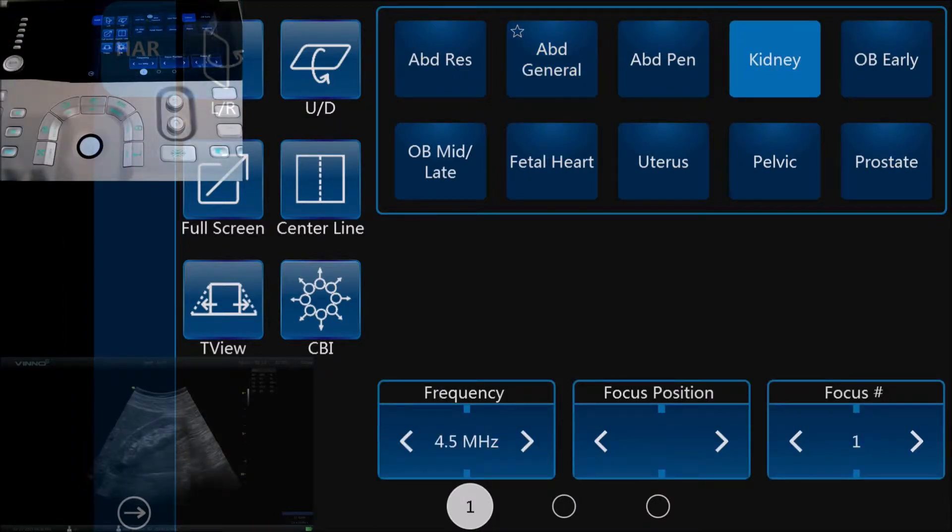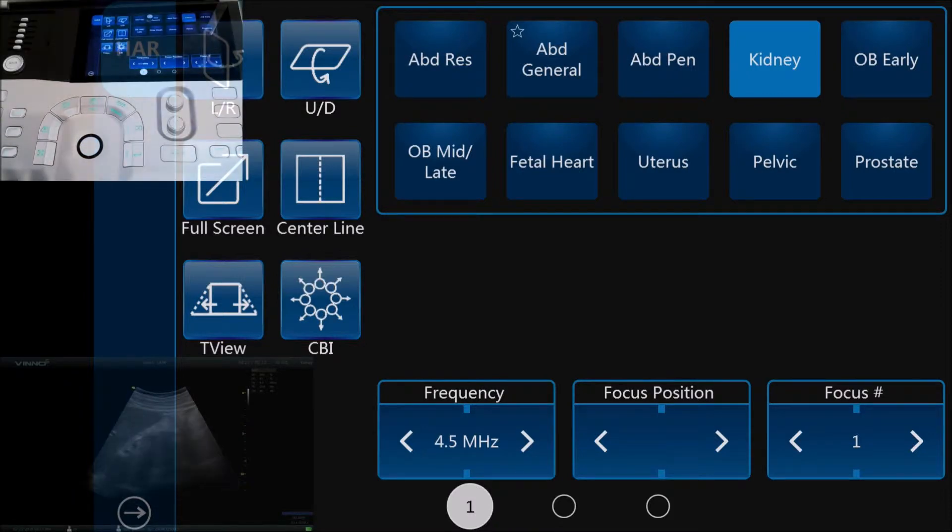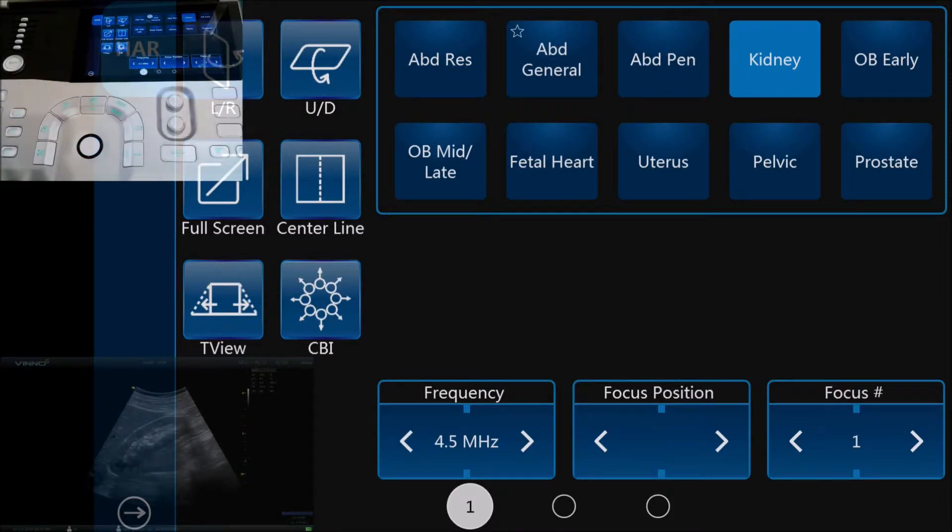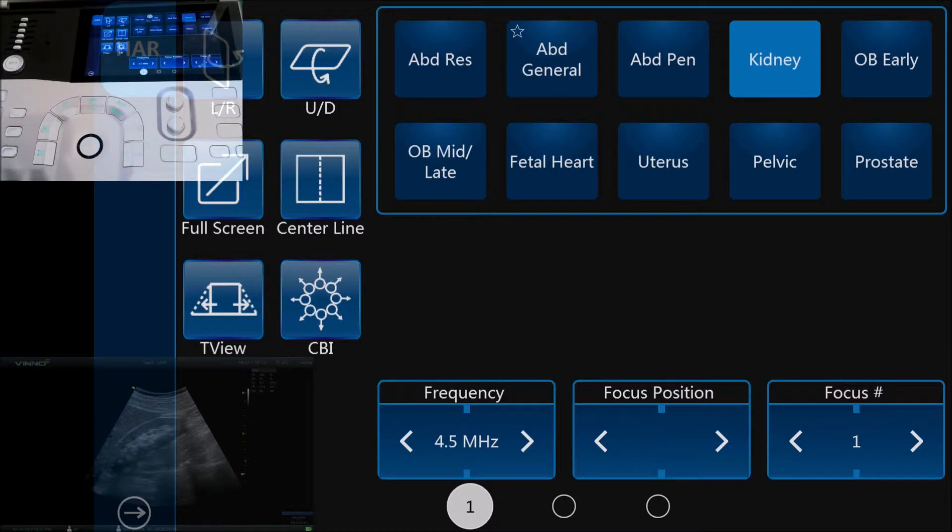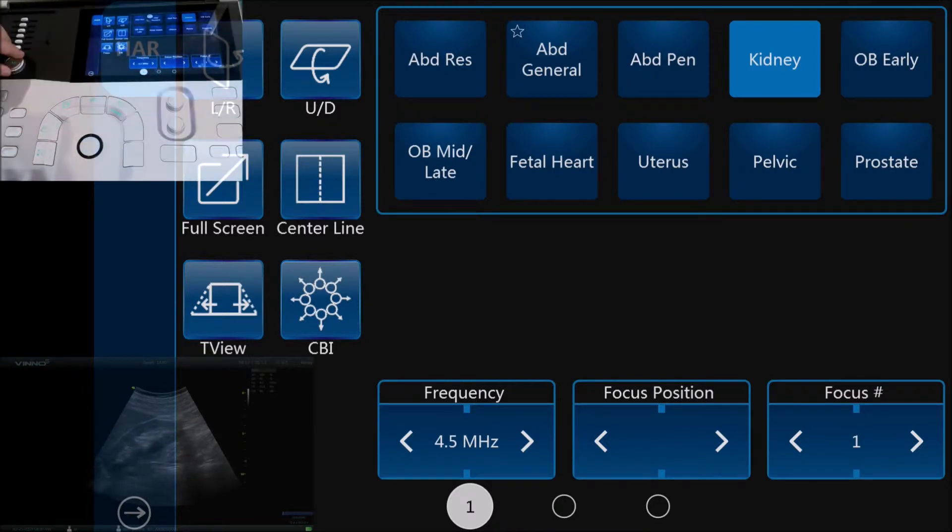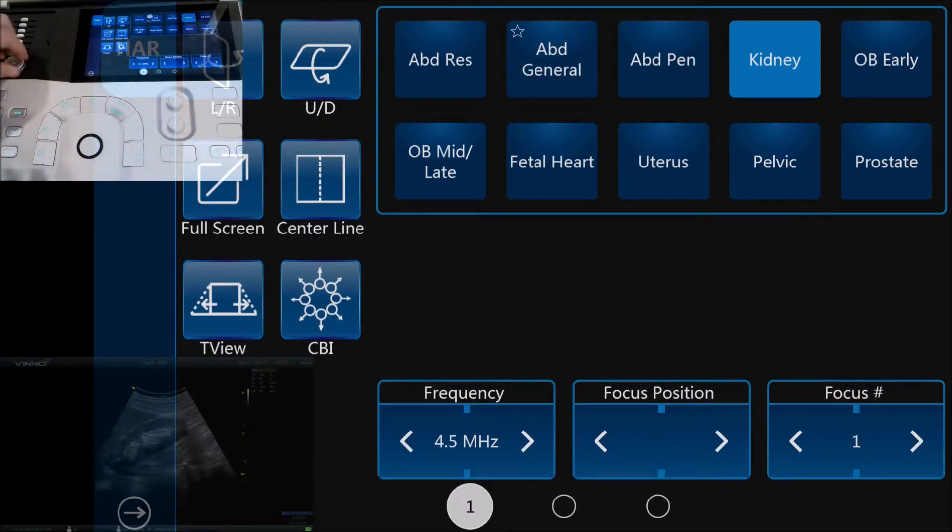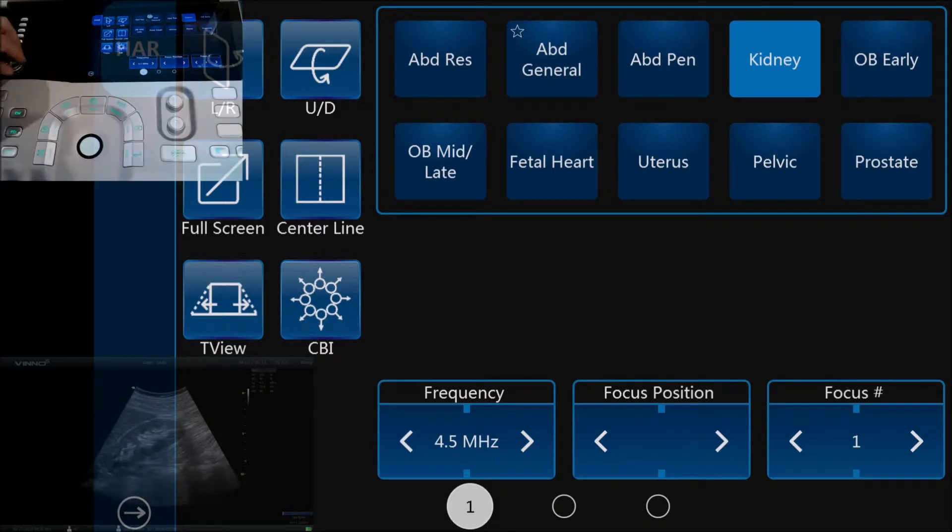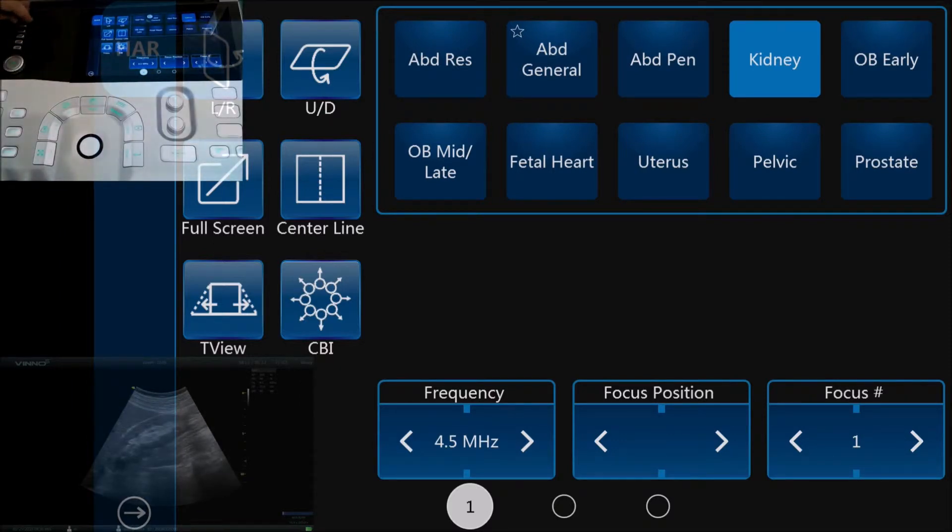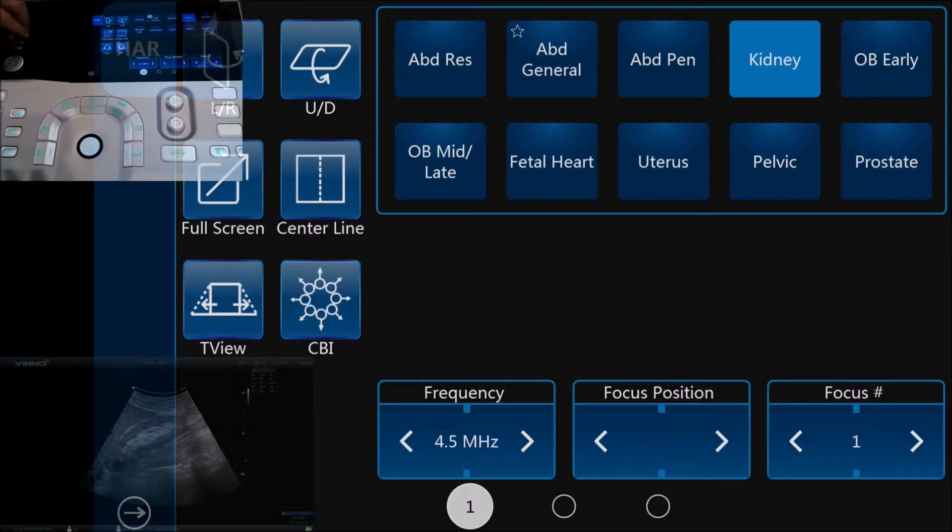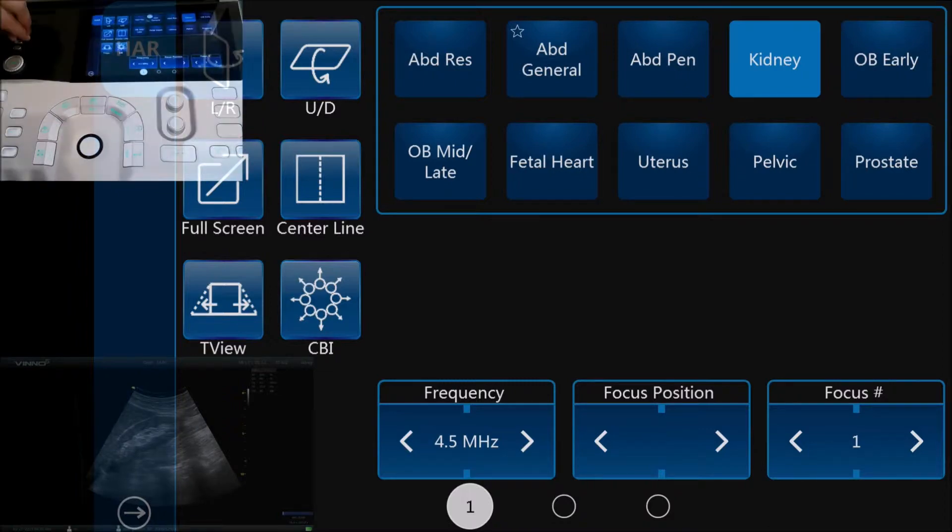The next thing we're going to do is take a look at the image optimization presets. In the top left hand corner we have the gain, so we can increase or decrease the gain to get the right brightness for us. If we need to, we can change the TGC sliders at the top as well.